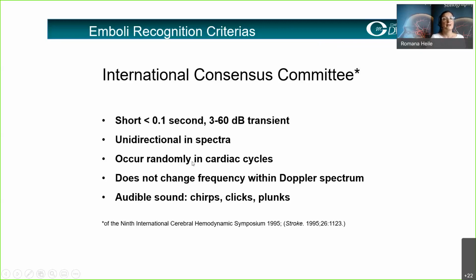So for instance, let's say there is an event and only 2 points are fulfilled to be an embolus and 3 are fulfilled not to be an embolus, then in this case, it will be counted as an artifact. But if the observer goes through again, then he can change it, because a human observer will still be able to do the correct identification. So then it can be correctly counted by manual reviewing.